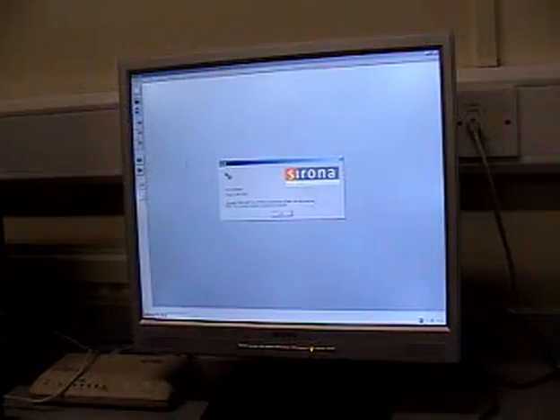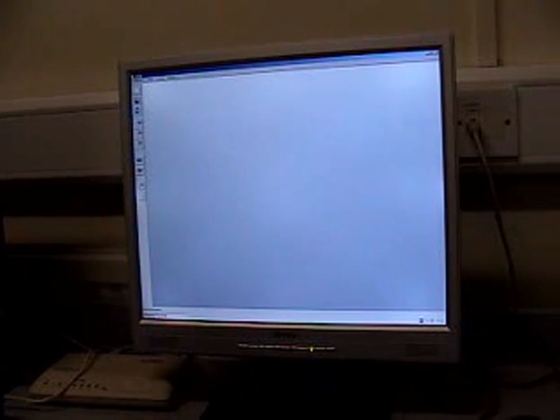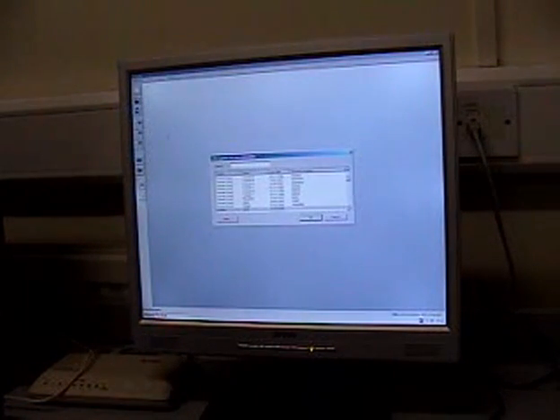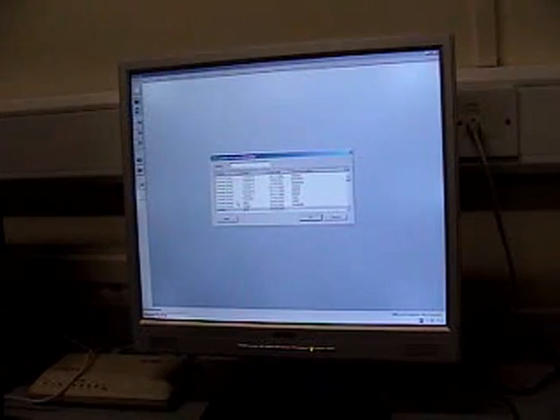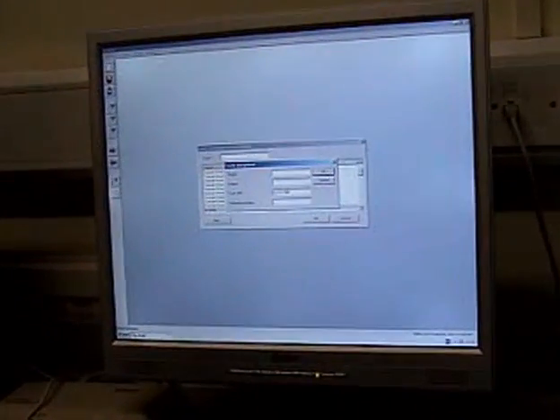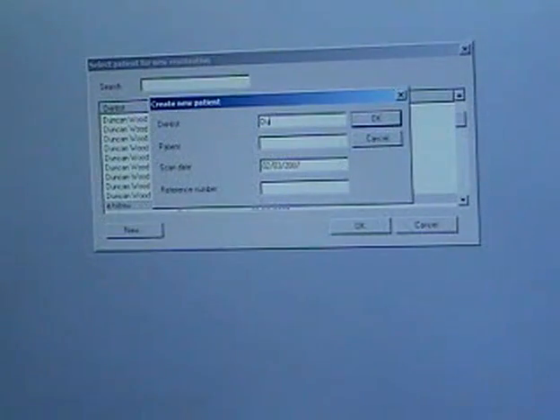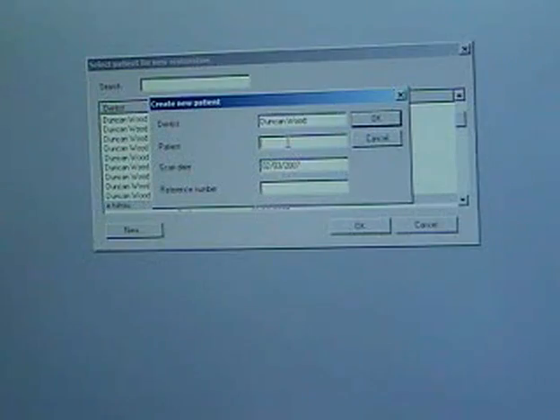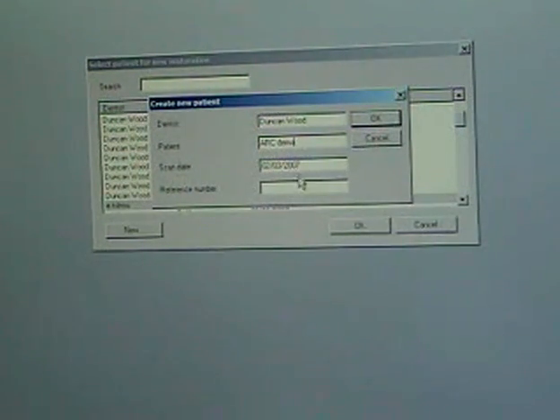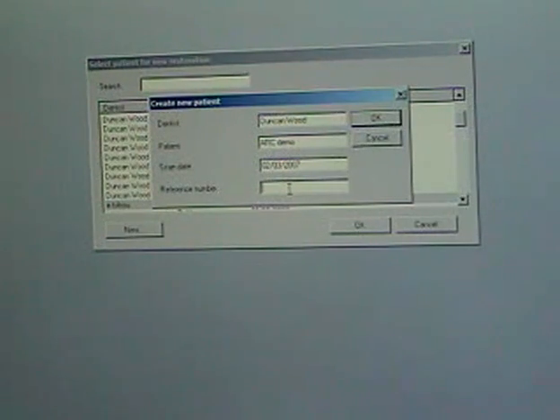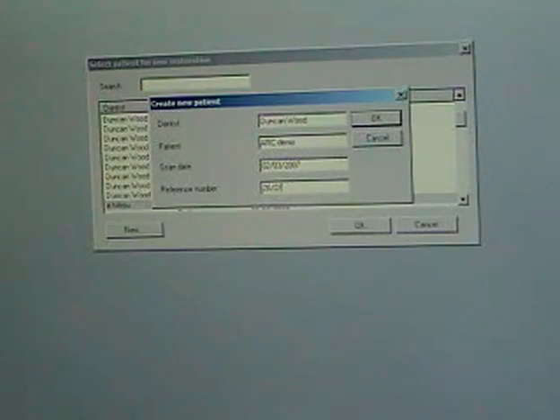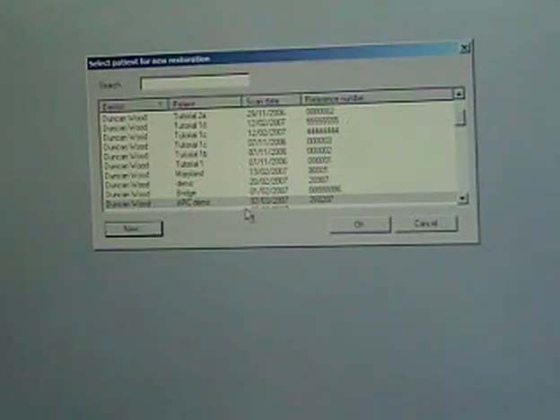So the software is starting up here. Now the scanner, it's worth mentioning, is an optical topographical scanner so it's looking at changes in light reflectance to get a three-dimensional image of the prep. So this is tapping in a new patient here. The name, the dentist as it calls it in the system, the scan date and the reference number needs to be tapped in. And then when you've done that you're allowed to start the design and acquisition process.